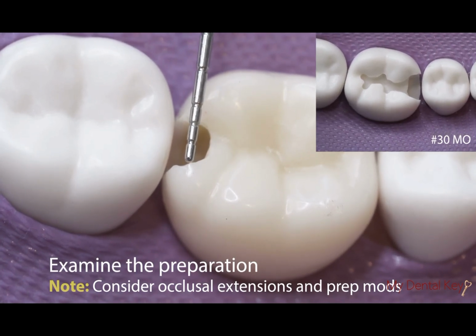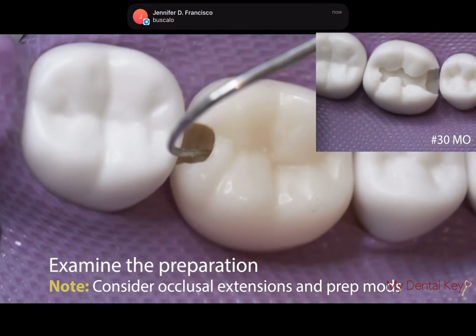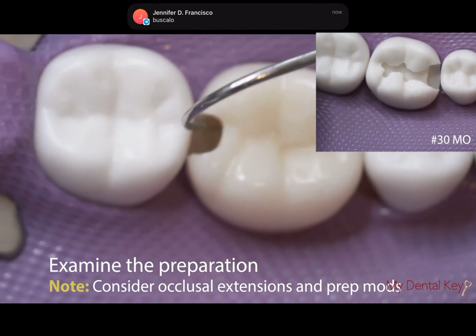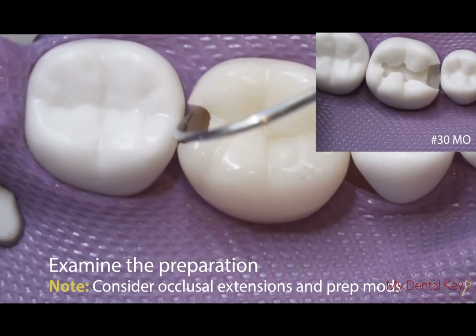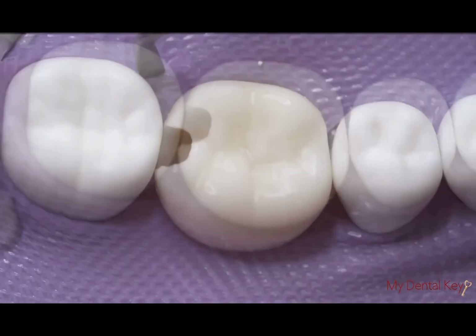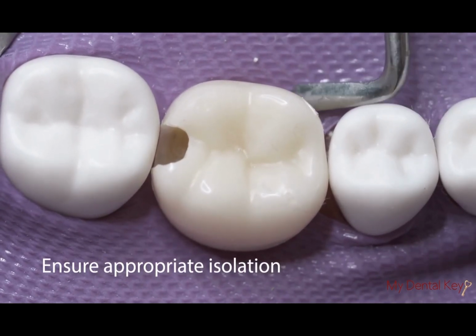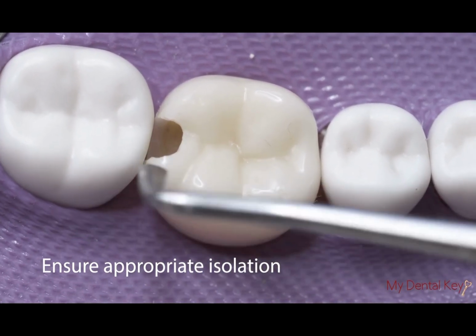For tips and tricks on how to prepare and restore an occlusally extended or conventional Class 2 preparation, watch one of our other MyDentalKey videos on our website at www.mydentalkey.com. Whether working with a typodont or human patient, you must perform your restoration under a rubber dam isolation.